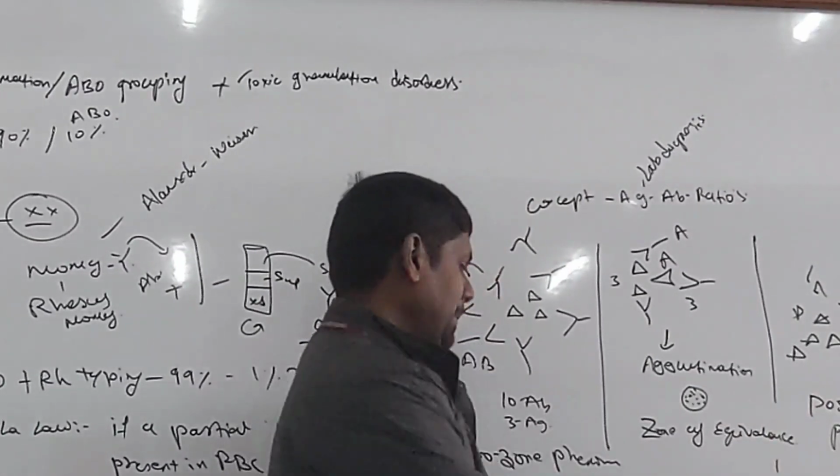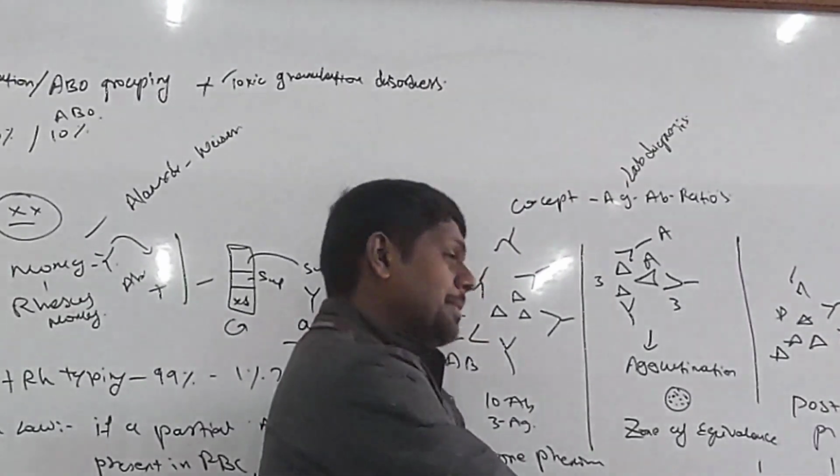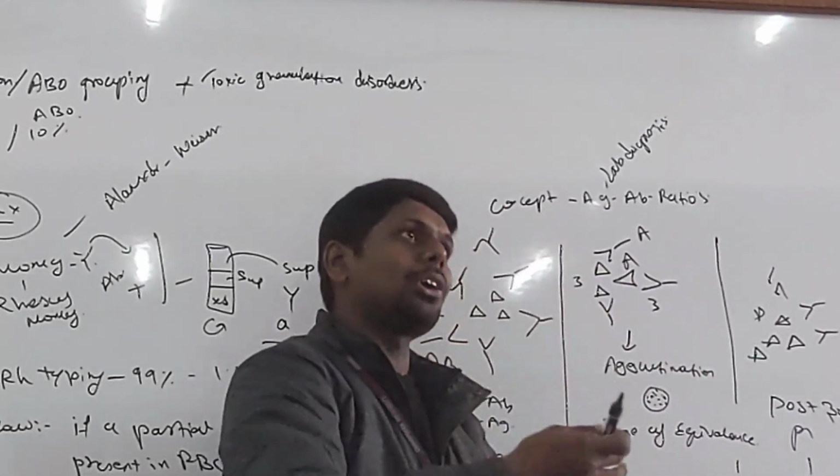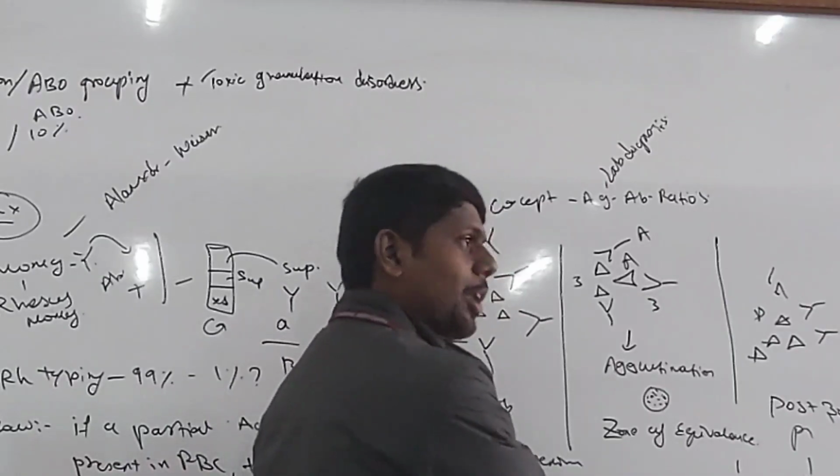Yeah, listen, during mixing, the students, what they will do, sometimes you forgot, you mix this side and psychologically you thought you were doing correctly, but you cross-contaminated.